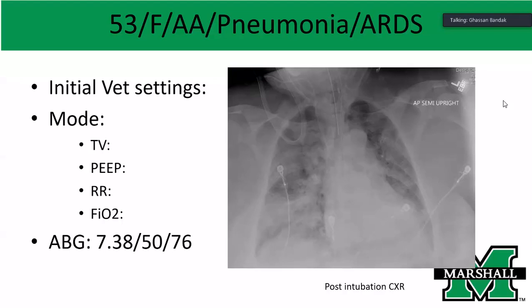But we're going to talk now about how you can actually titrate these numbers. Is it better to start small, then titrate up? Depending, no, not necessarily, because after you intubate, you sometimes de-recruit. And when you de-recruit, it will take a lot to recruit, okay? Some vents, we bought these but haven't started using them, have a built-in recruitment maneuver. After you intubate, you do a recruitment maneuver, and the vent will show you how much volume you recruited, right?